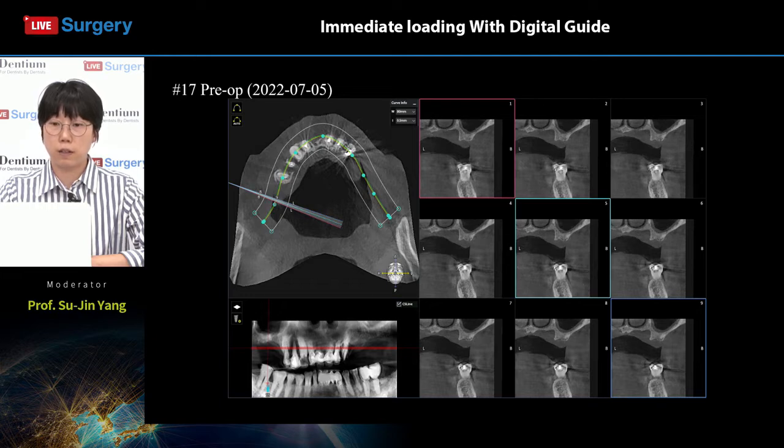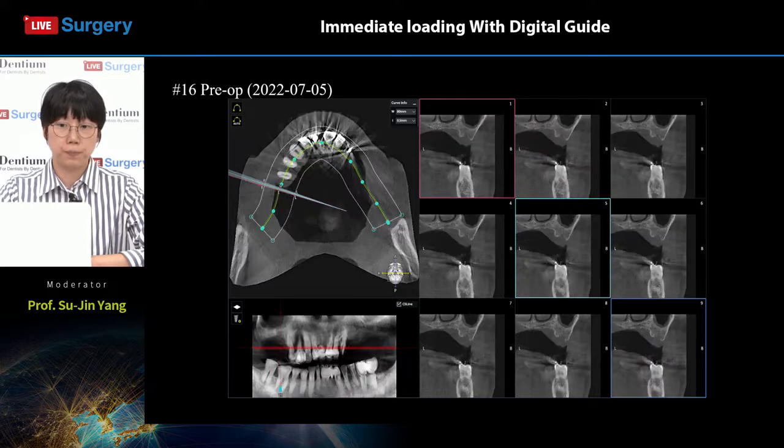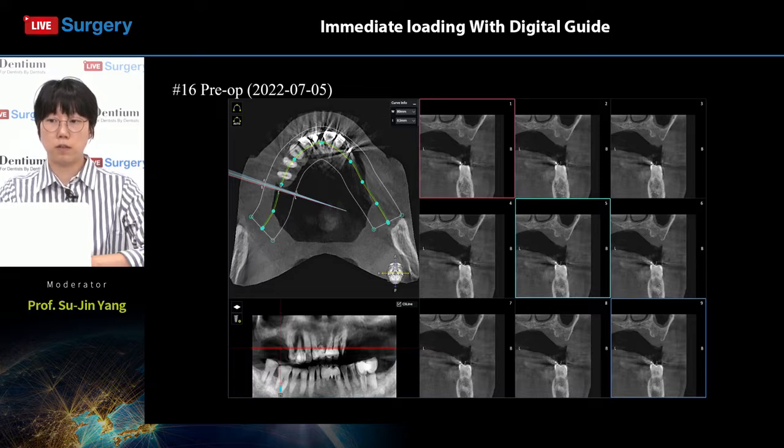The tomographic images of the patient show detailed bone volume around the implants. Tooth number 17 area shows sufficient bone width, but not enough bone height. Tooth number 16 area has more bone compared to tooth number 17, but still a small amount of sinus floor elevation may be necessary. We'll have to check during the surgical procedure.